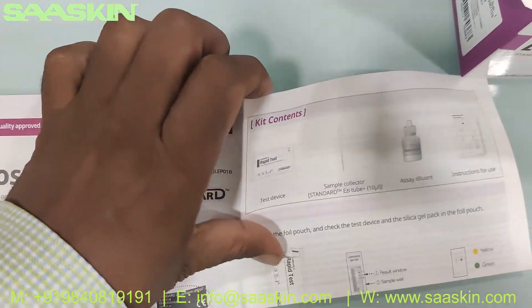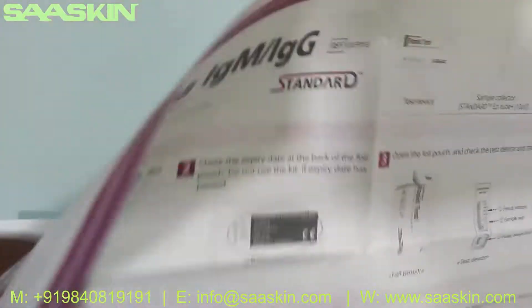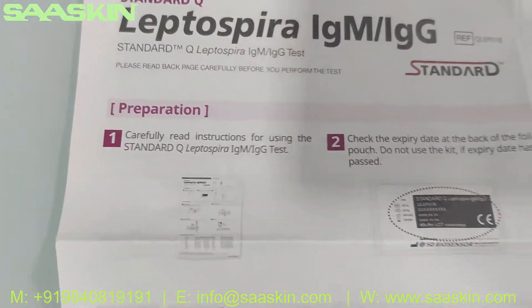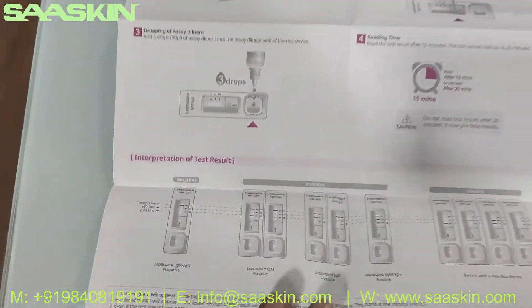It's a detailed brochure. You can see here: Standard Q Leptospira IgM IgG antibody test kit. You get the preparation, test procedure, and interpretation of results. This is how the brochure looks like.